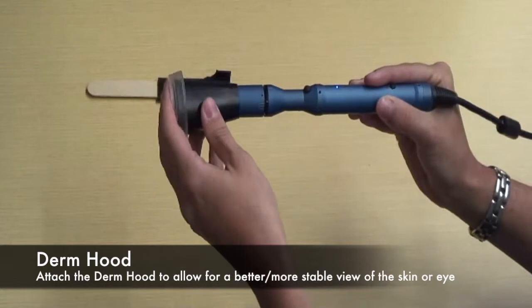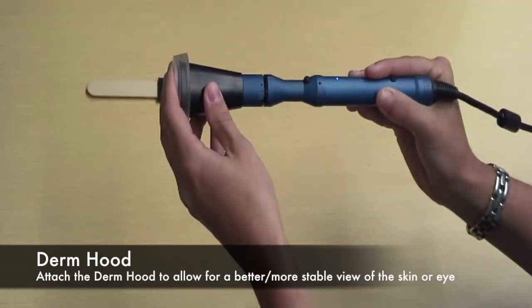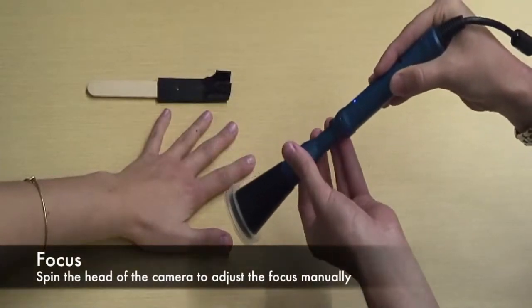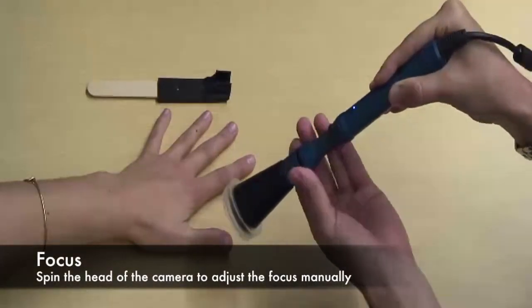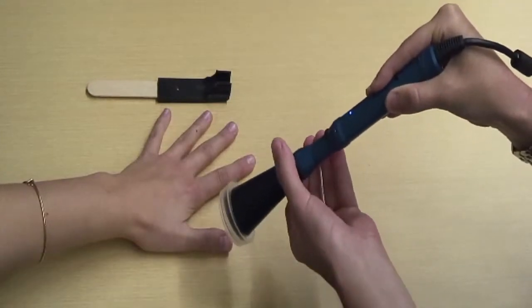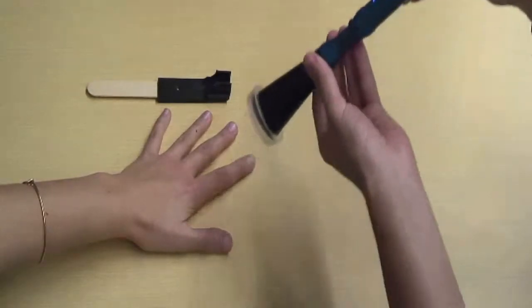Attach the derm hood by gently placing it over the head of the camera. Hold the camera a few inches away from the desired area and spin the head until the image becomes clear.